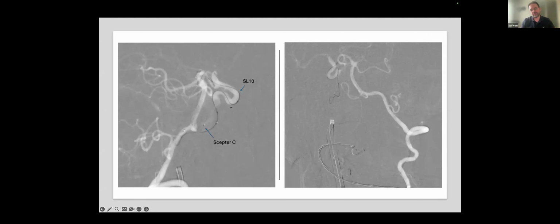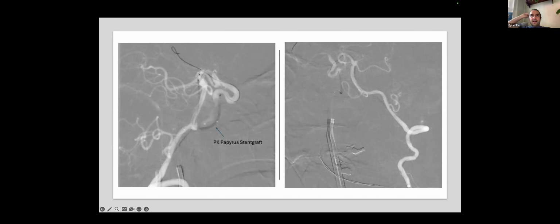So it was just putting the wires next to each other, rotating the tip of the wire to go around the first wire, and then just pushing it to go around and go through completely. So you use the wire as your map to know where to go. Exactly, I use the wire as my map. You can call it the reverse sheathing technique. Yes, exactly. Thank you.